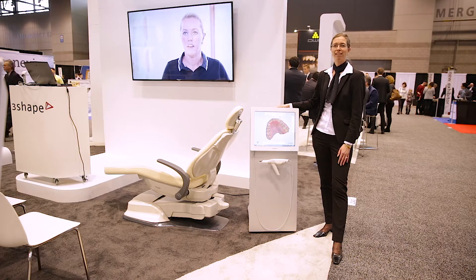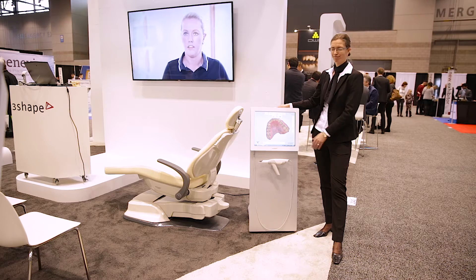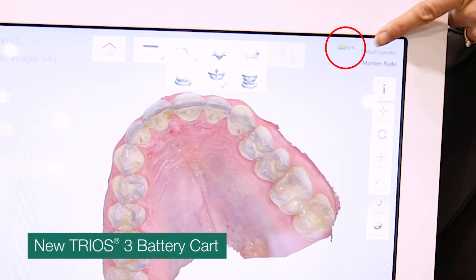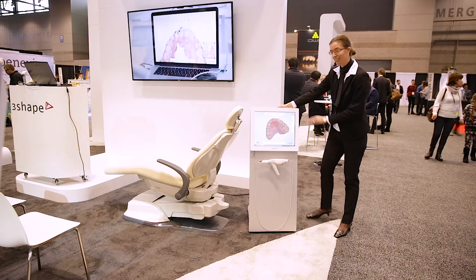This year we have made the Trios 3 even better. It now comes in a version with a battery cart. Let me just show you.